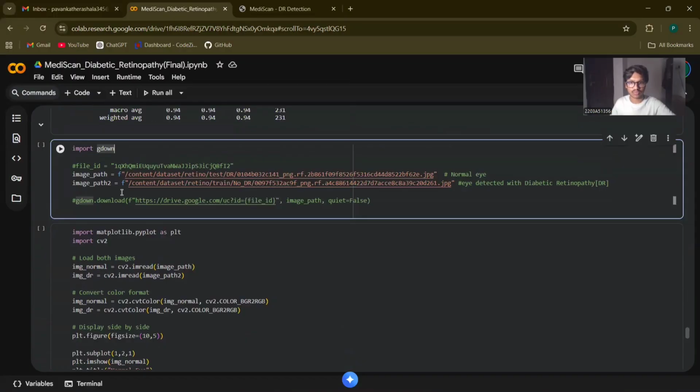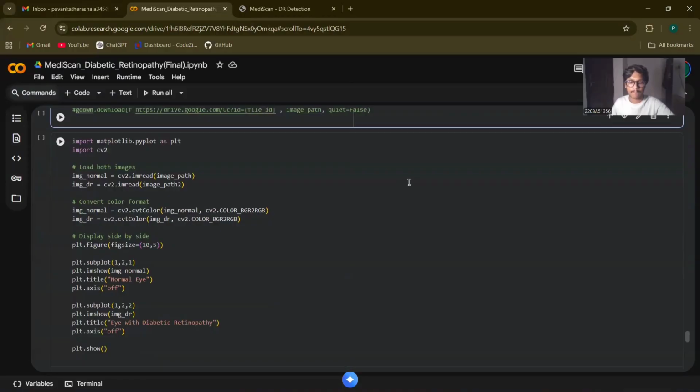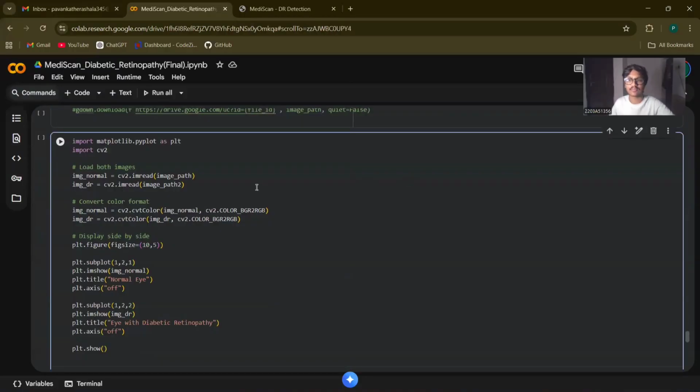Here, we took two images. The first image is a normal image, and the second one is the image which is infected by diabetic retinopathy. So in the next block of code, this code section is dedicated to visualizing the two sample retinal images side by side. This is a crucial step to qualitatively assess the difference between a healthy retina and one affected with diabetic retinopathy before running the deep learning model.